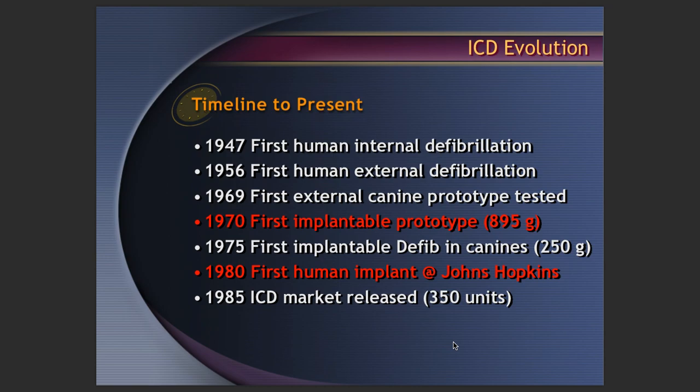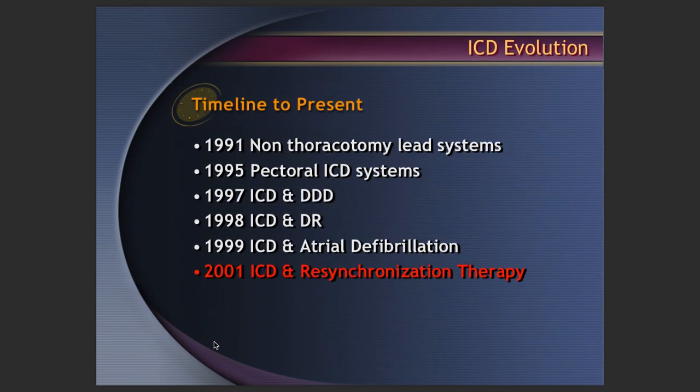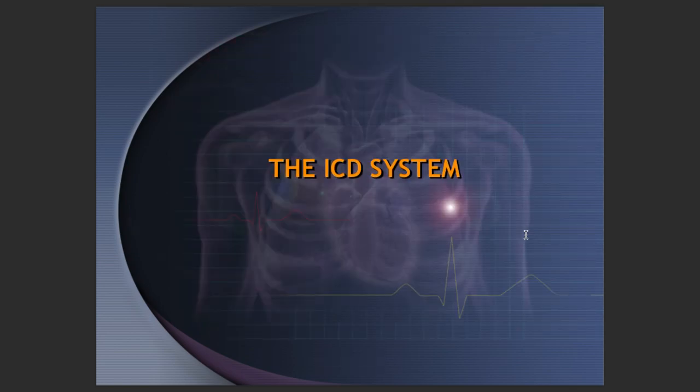Later on, around 1985, the first ICD market release was done. It was a limited release, in fact. Even after that, a lot of changes have been going on in the evolution of this device. So the DDD mode, the DR mode, or otherwise the ICD used with resynchronization therapy as well.